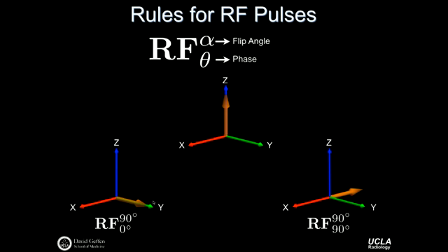So think of it, it's a left-hand rotation this way. It's curling about x. 0 degrees means the field points along x, or that the torque points along x, and it curls down along y. If I now take my hand and say my phase changes by 90 degrees, I'm pointing my thumb along y, and that's going to cause my magnetization then to tip from z down along minus x.